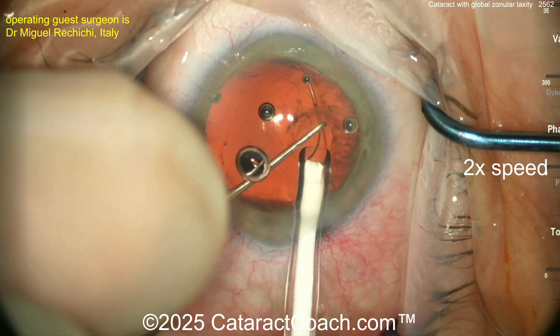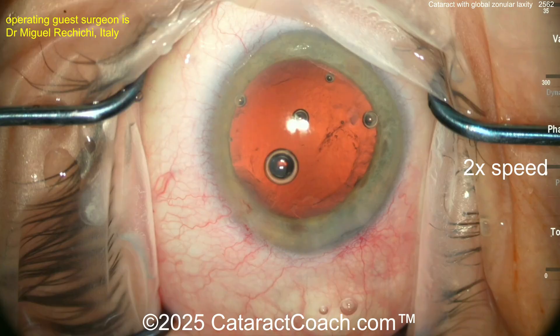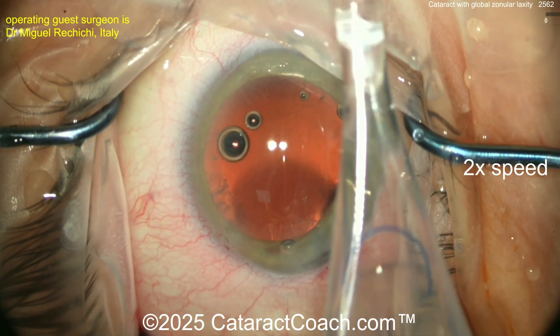Here's the trailing end of it, and you can see the leading part coming up behind it too. Now you can see both eyelets in the capsule bag — nicely done. Here comes the lens; looks like a three-piece lens.